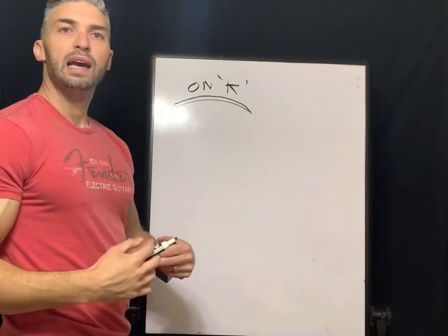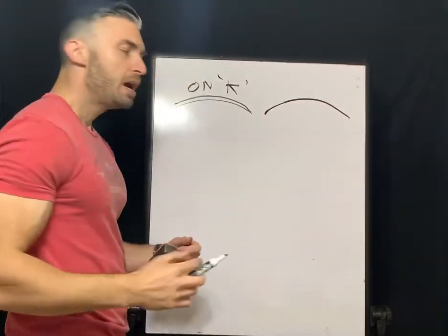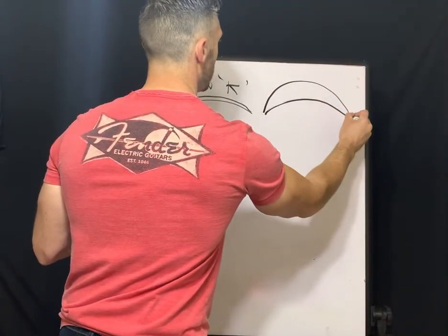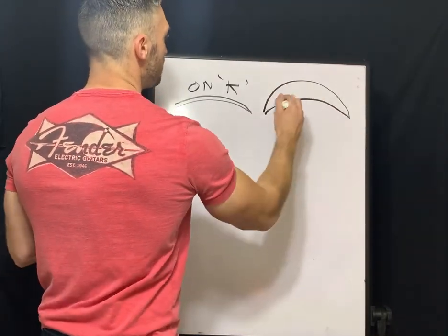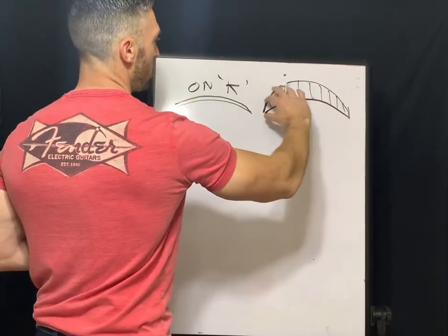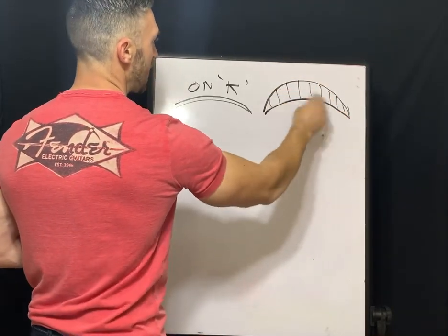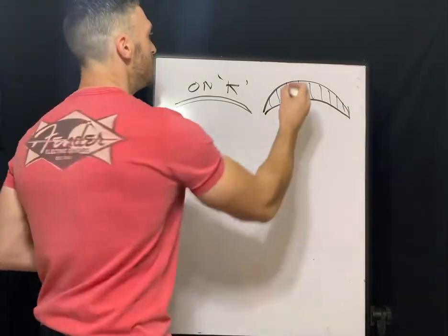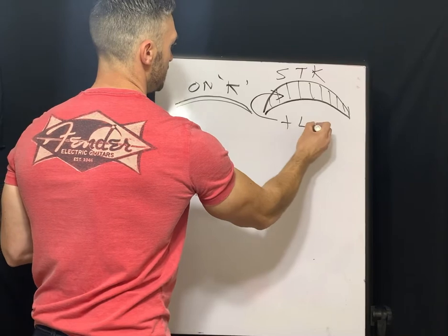So when we fit something that is steeper than K, let's look at that. If we have our cornea again, but let's say we want this lens really steep. This will be an over exaggeration, called hyperbole, just really illustrating it. So a really steep base curve, and what's going to happen is, if that's our tear lens, our lacrimal lens that goes between the base curve of the contact lens and the cornea, the anterior surface of the eye, this is creating what looks like a plus lens. You can see that. So it's steeper than K. The lacrimal lens is a plus lens, right?